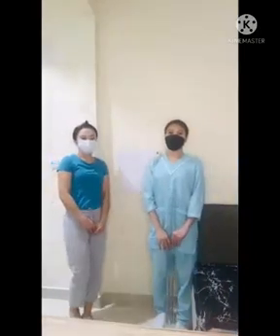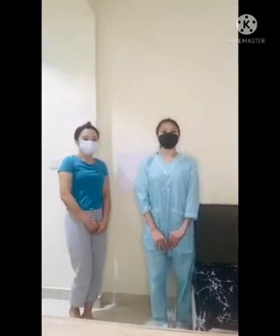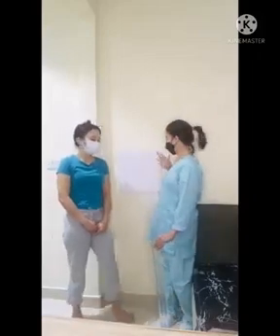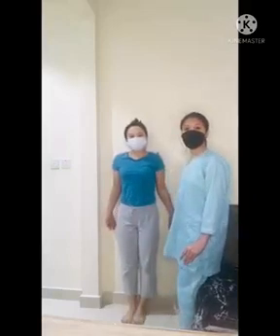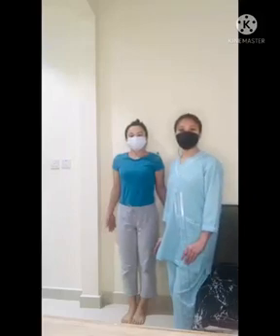The projection that we're going to do is the chest AP. So, the patient is facing the tube, and the posterior part of the body is in contact with our IR. The hand of our patient is like this. A standing position is recommended to place the diaphragm at its lowest position, where air fluid is seen.